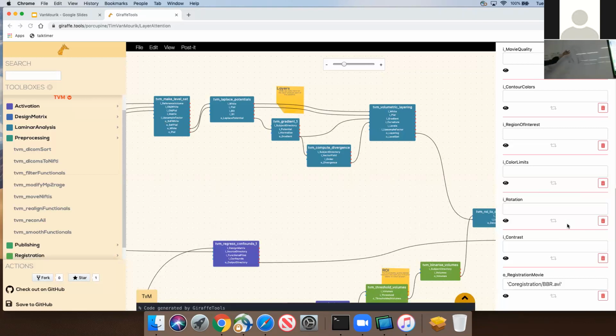And what you could do with these intermediate surfaces is, again, just going from one side to the other and interpolate your volume at different points. But there is a different way. One of the problems with this way is that you get some inherent blurring and some leakage from one layer to the other, because a gyrus always lies inside a voxel grid.